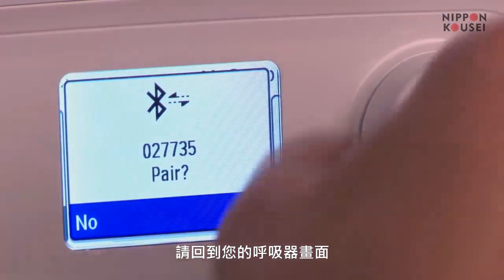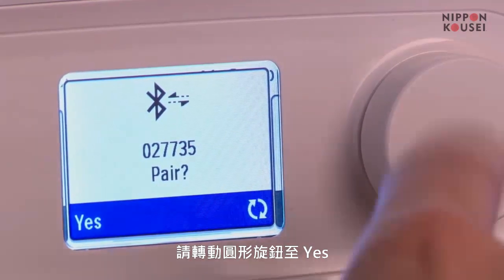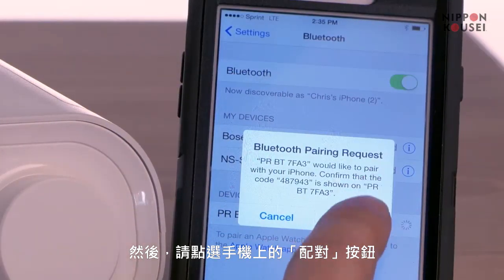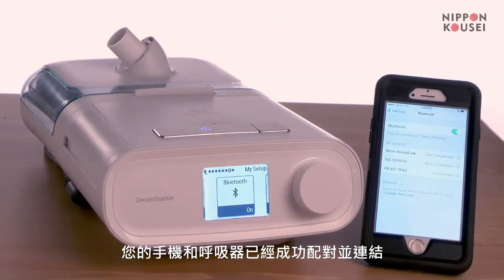Next, return to your device. Your DreamStation will ask if you would like to pair. Turn the knob to Yes and press to confirm. Now, tap Pair on your mobile device. A connected message lets you know that your mobile device and DreamStation are now paired together.